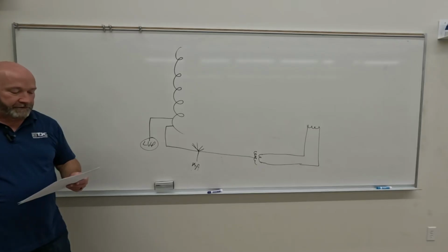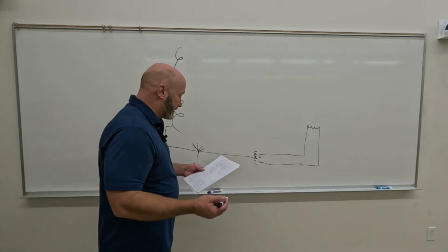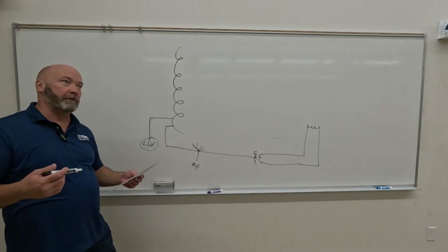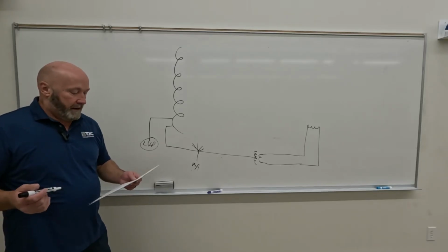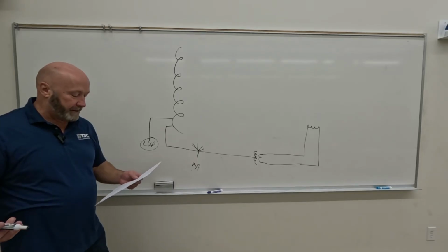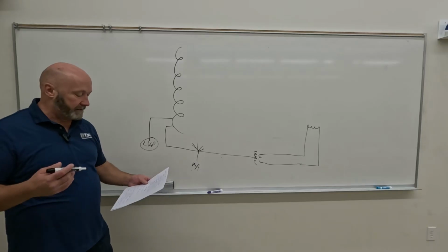It creates space charge and controls filament current. It is a rheostat. It's an mA selector. It utilizes a step-down transformer to lower the voltage, so that again we don't send electrons early. So it works off of low voltage, 3 to 5 amps. It creates a space charge, and we talked about saturation current and the space charge effect.